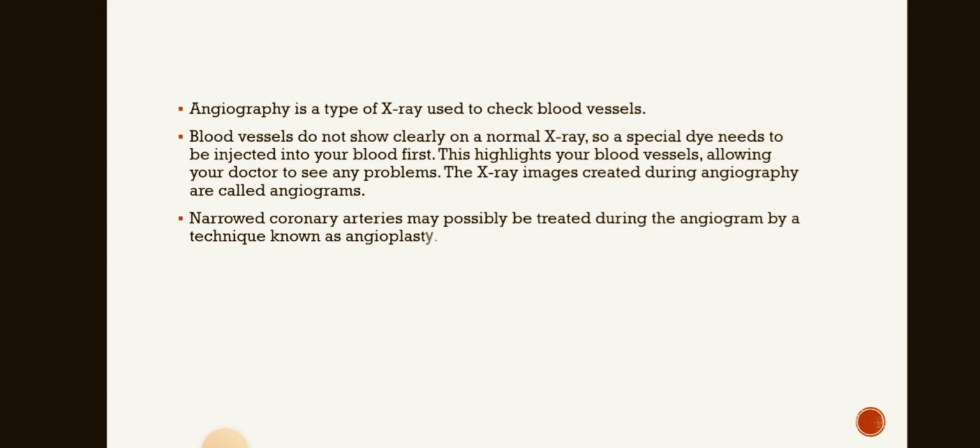So during this procedure, also known as coronary arteriography, the patient is positioned on an X-ray table. Depending on the condition of the arteries, either the underarm or groin area will be disinfected and then numbed with an anesthetic. A long, narrow tube is then inserted into a large artery and gently threaded up into the coronary artery around the heart muscles. A special dye is released from the catheter and X-rays are now taken. The doctor will review the X-rays taken to pinpoint the location and severity of any narrowness. If a block is found, that will be removed using the desired method.